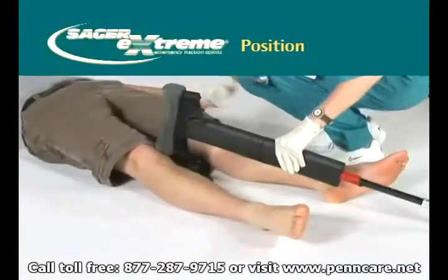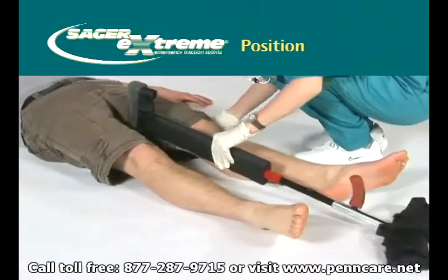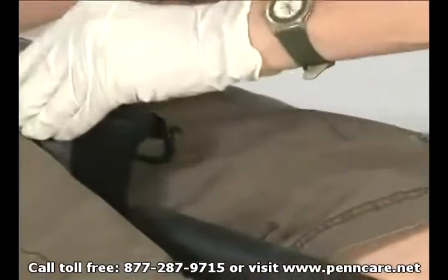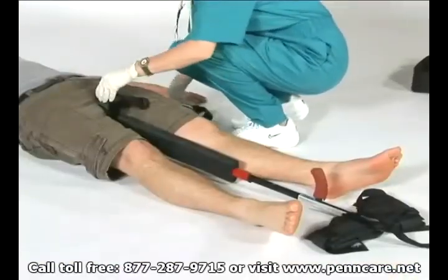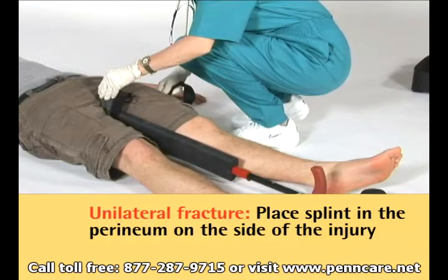Position the Sager SX404 between the patient's legs, resting the ischial perineal cushion or saddle against the ischial tuberosity, with the shortest end of the articulating base towards the ground. In the case of a unilateral fracture, the splint should be placed in the perineum on the side of the injury.